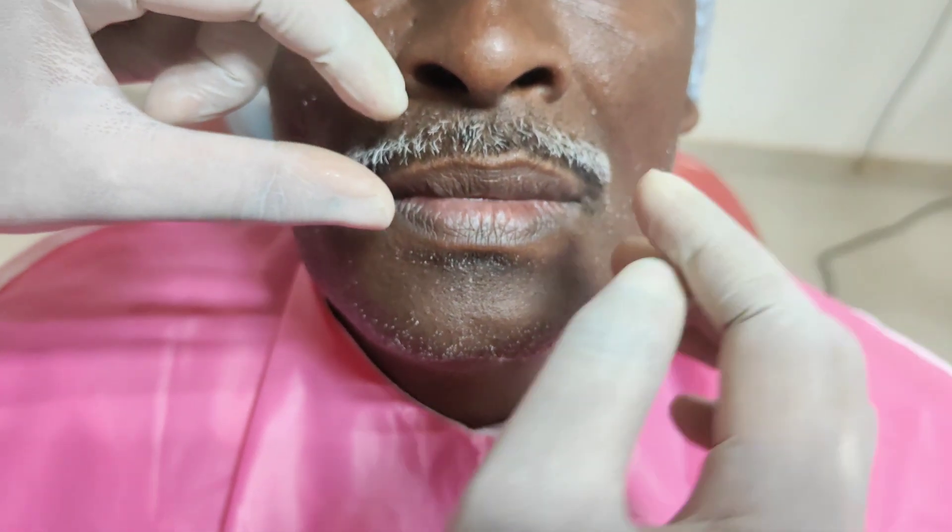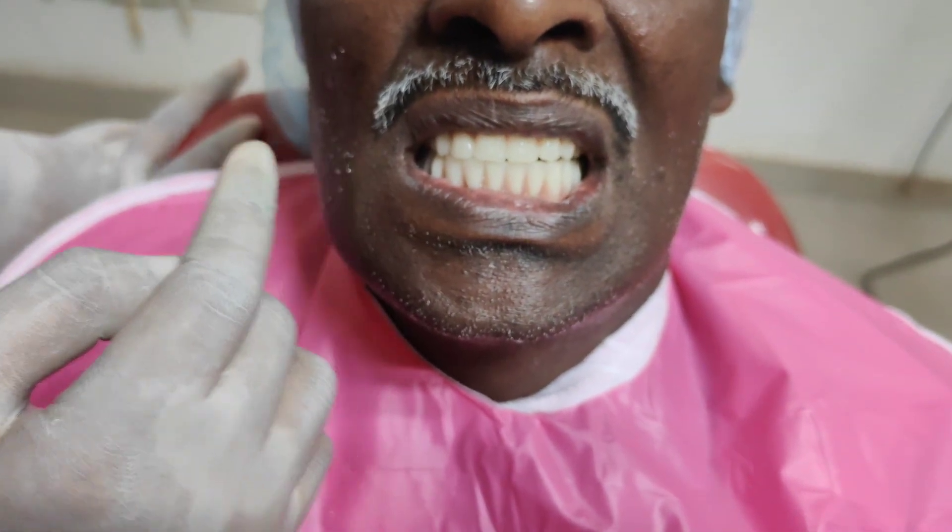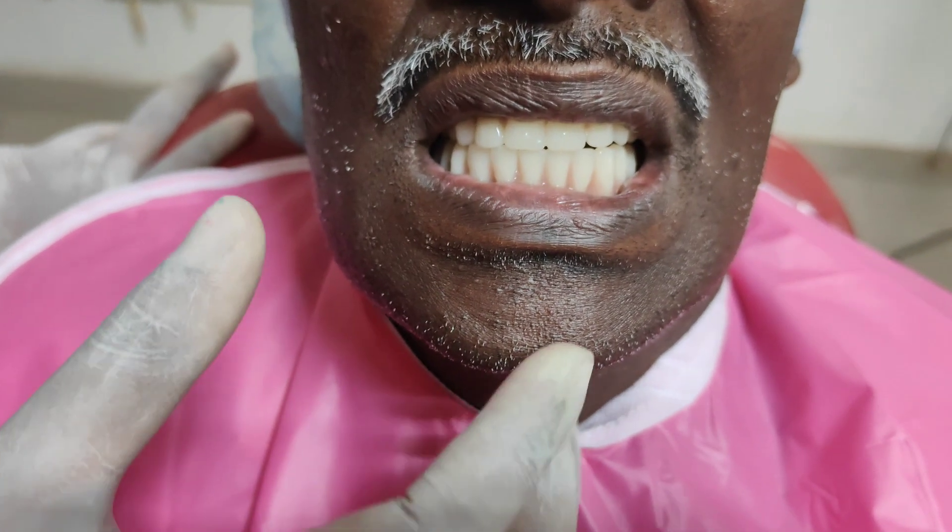The aesthetics of the denture must be examined, as aesthetics plays a major role during denture insertion. The facial midline should coincide with the dental midline, and the philtrum of the lip should coincide with the midline of the central incisor. The patient is asked to smile slightly so that the incisal edges of the anterior teeth are visible, and then to give a broad smile so that the gingival margins of the maxillary denture are visible, indicating perfect aesthetics.